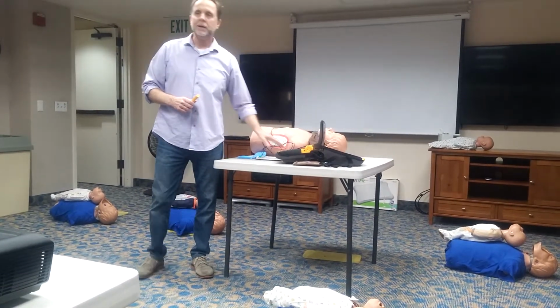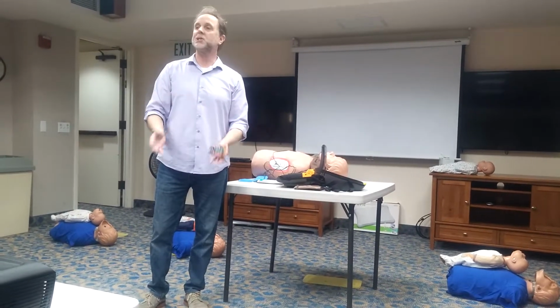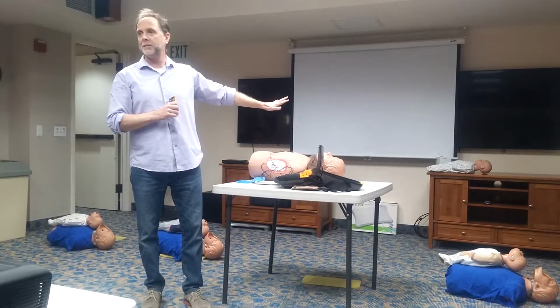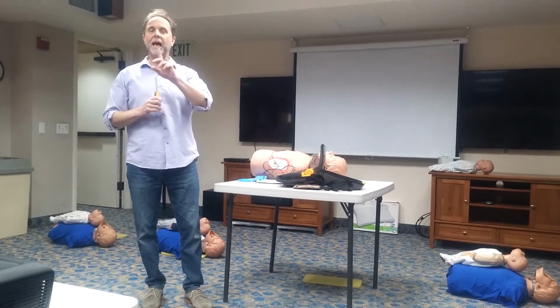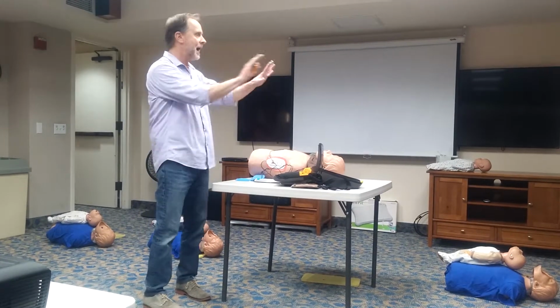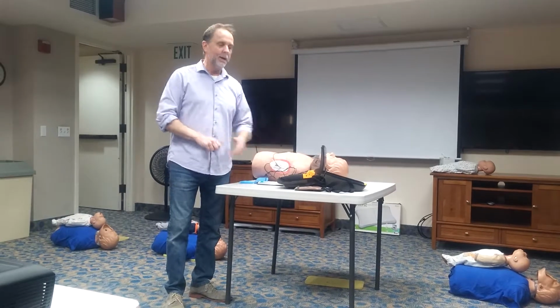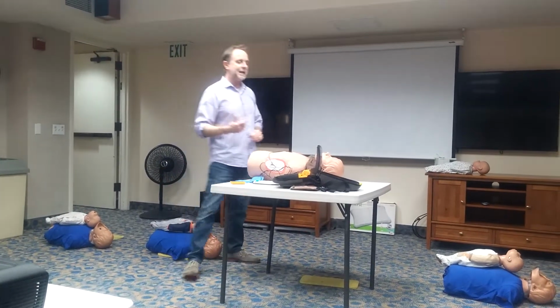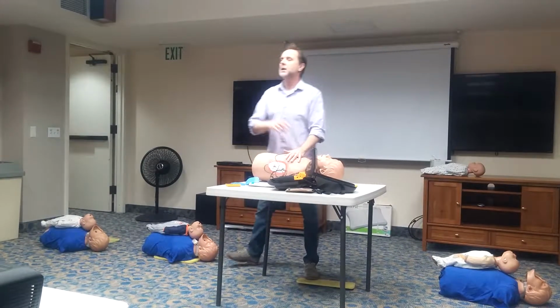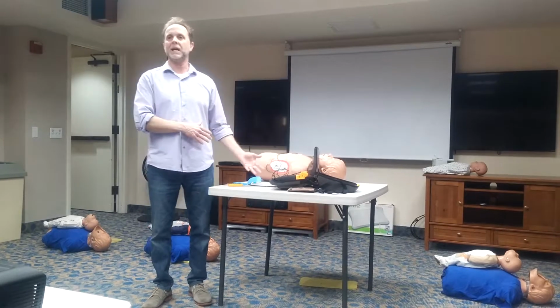Evaluating heart rhythm. Now here's a critical step. If it detects one of those two heart rhythms, it's going to load with energy. We're going to shock the victim. Nobody can be touching the victim. As the operator of the AED, I make sure nobody's touching the victim. I'm clear, you're clear, everyone's clear. I press the shock button. Then we go right back into our CPR, chest compressions and ventilations. The machine will automatically count down 2 minutes for us and reanalyze.